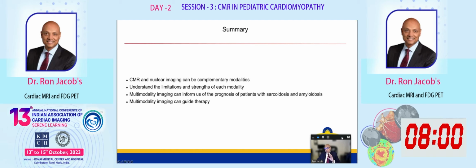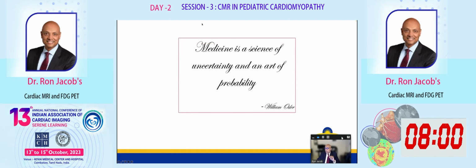There are some desmoplakin mutations, for example, that will look very much like sarcoid. The PET scan will also light up, and it's hard sometimes to distinguish. And you've got to look at the EKG, the clinical picture, whether there's any extracardiac activity to really make a diagnosis. All right, I'll stop there, and I will take questions.